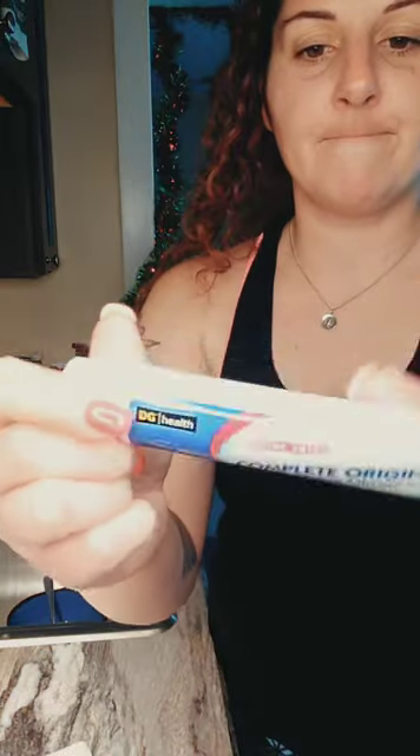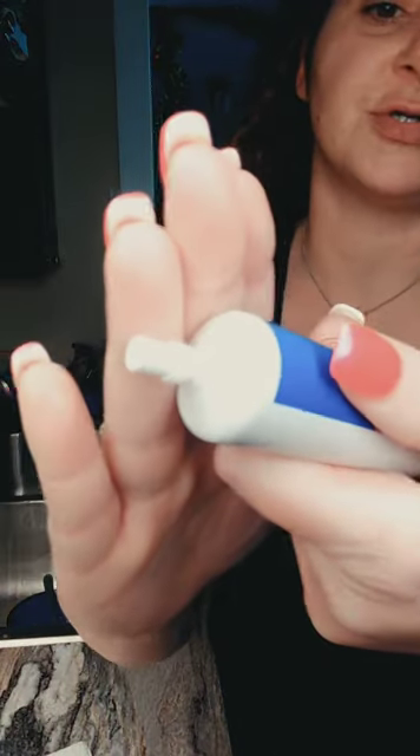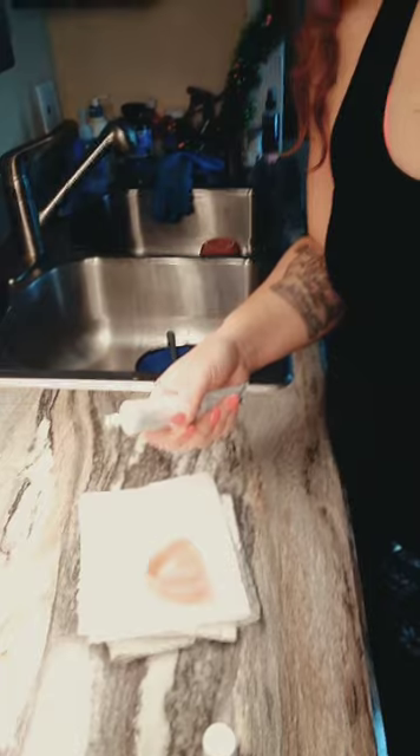Always clean your denture, make sure it's dry. So here's the tube — I'm gonna show you the nozzle, which I don't like because it's big and thick. I like the Fixodent Scope one with the thin nozzle. But either way, I spread it out anyway, so let me show you guys how I do this.